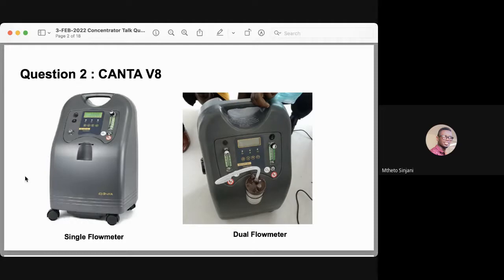But if that's not the case, the first and the most simple test is to use a pressure gauge to measure the output pressure of the compressor. If you don't have a pressure gauge, you can use one that is designed to test the pressure in vehicle tires. So to test the pressure, you must locate the hose that feeds compressed air to the solenoid valve. Disconnect at the solenoid valve and connect the pressure gauge there. Once you have turned on the power, the compressor will run and the gauge will show the maximum pressure that it is capable of reaching.